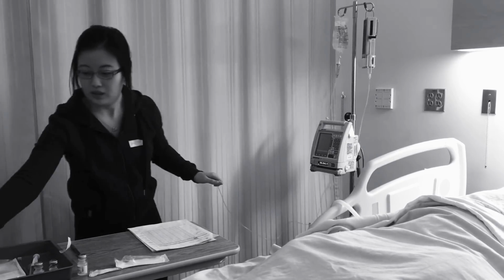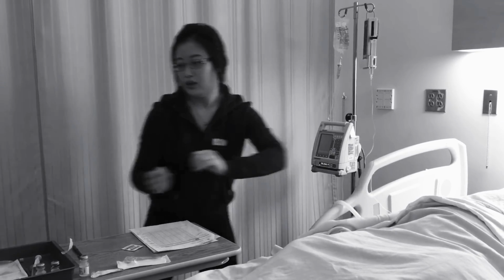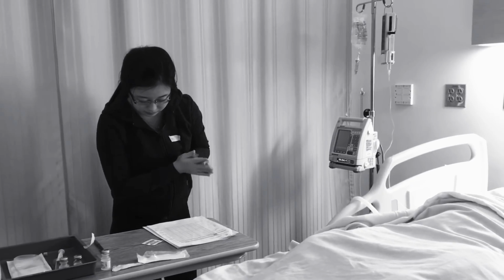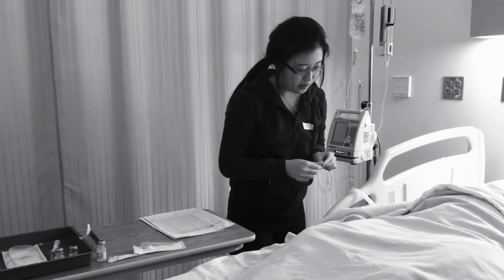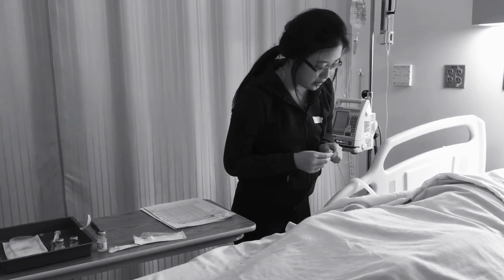I will do my further tasks. So before I connect it, I'm going to do hand hygiene. And I'm going to check the site. The site is still patent. It doesn't look like there's any redness or swelling.